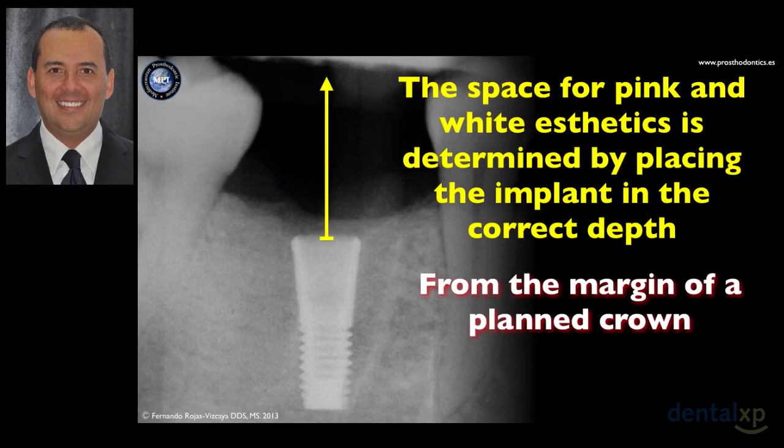If you are doing a full mouth reconstruction using dental implants, for every crown where you are planning to place your implant, you will make this analysis, and maybe for every implant bone is at 3 mm, or maybe it's more, and it's an indication for a different type of restoration, or maybe it's less.